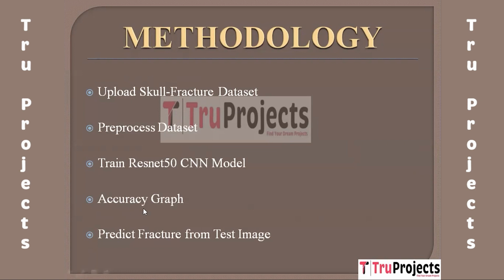The next module is Accuracy Graph. Using this module, we will plot the ResNet 50 transfer learning CNN accuracy and loss graph. The next module is Predict Fracture from Test Image. Using this module, we will upload a test image and then the CNN will predict whether the image is fracture or non-fracture.